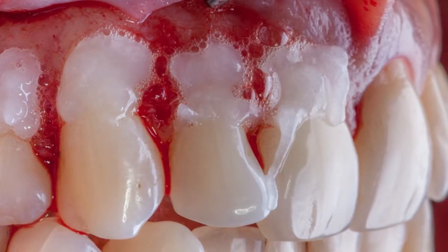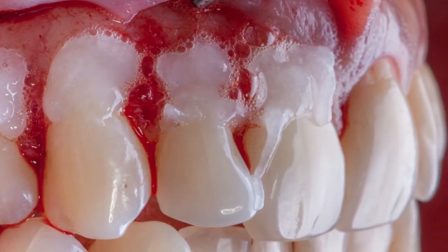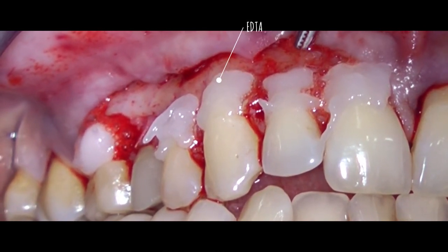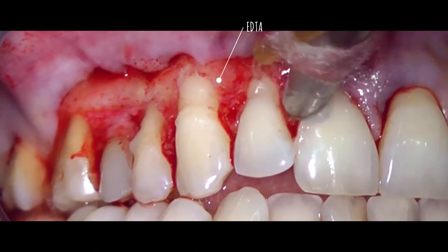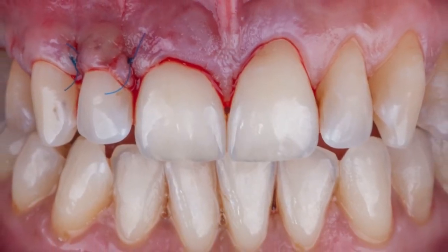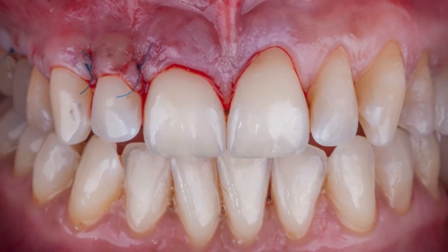The use of EDTA for a period of 2 minutes will allow for the smear layer removal and hopefully improve the fibrin clot adhesion. We are now ready to suture.